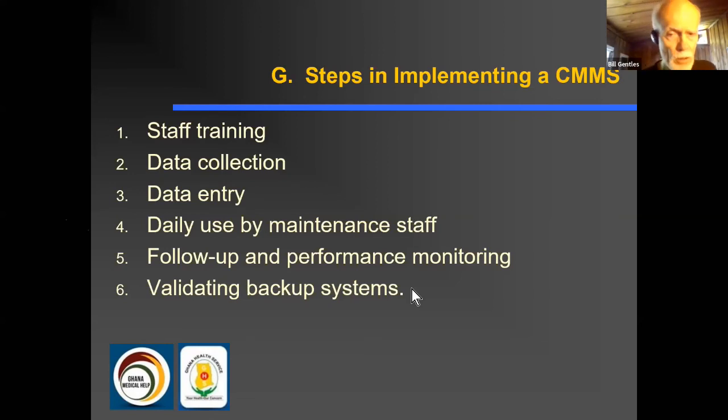It's very important once you start putting this data into a database that you simultaneously create a backup system, which is in a completely separate medium than the hard drive or the SSD on your laptop, because laptops have a habit of crashing when you most need them. And if you've lost all of your inventory data inside your laptop, you have to start from scratch. So as soon as you collect inventory data in an Excel spreadsheet, you should create a backup copy, preferably on a USB stick or some external memory that you can remove from your laptop, and so it's less vulnerable to ransomware, viruses, corruption. You've got a backup copy if anything bad happens to the original copy.